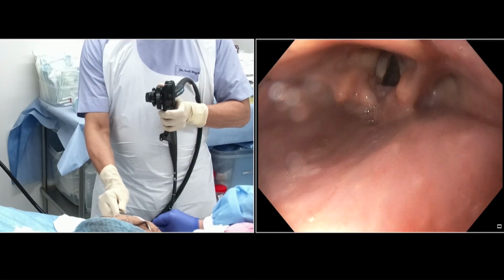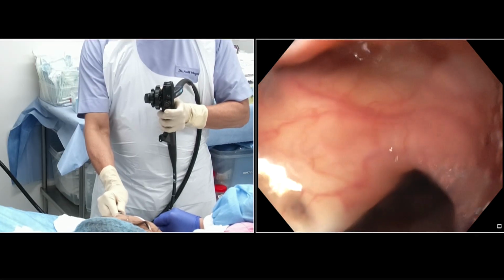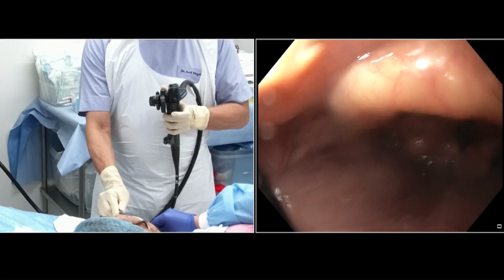So with this now you can actually even examine the supraepiglottic portion by turning the big wheel up, gently going here, turning the scope with your right hand, turning the shaft.